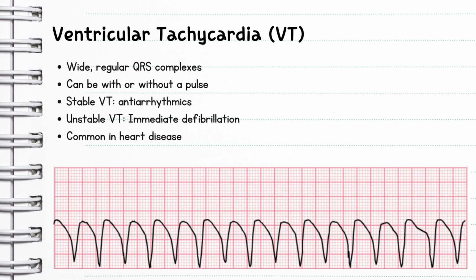Okay, so now let's talk about VTAC. Ventricular tachycardia, or VTAC, is another life-threatening rhythm that you're going to need to recognize as soon as possible, okay? One of the main characteristics of VTAC is wide, regular QRS complexes. If you look on the screen, they're all regular. They all look kind of uniform, but they're wide, right?